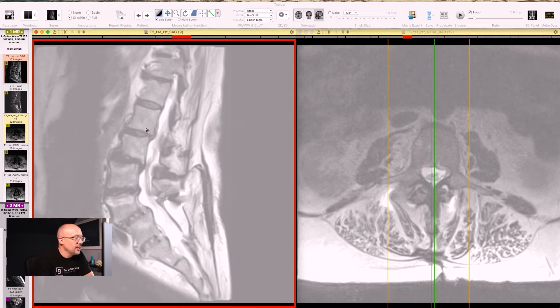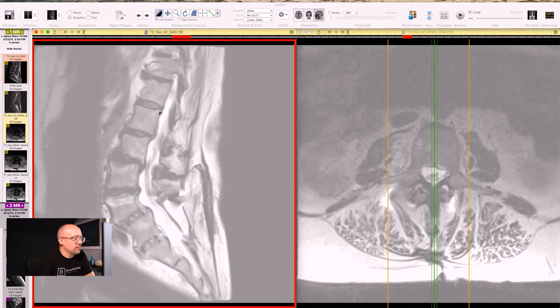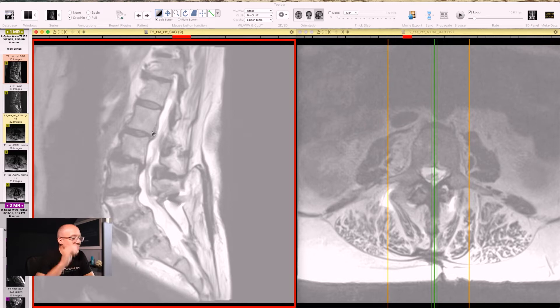In an ideal world, I'm going to go up to L5, 4, 3, 2, 1. L1. You can see this one I'm outlining right here. This is a nice square, right? This bone is square. The vertebra is square. It's nice and gray. It's clear around all of the edges. That is normal. That is a good looking vertebra.